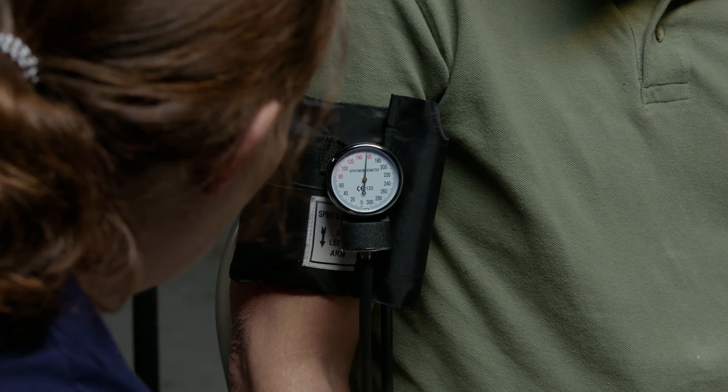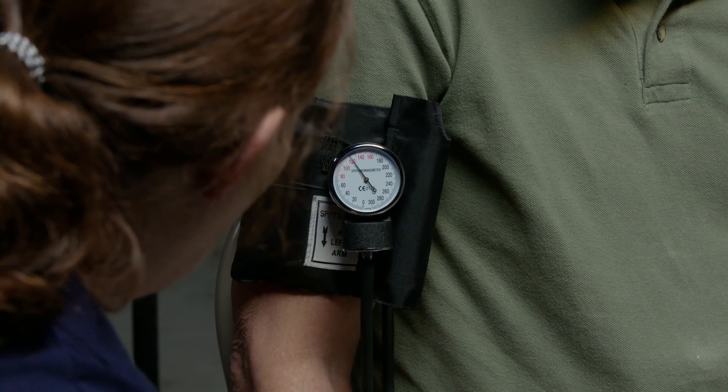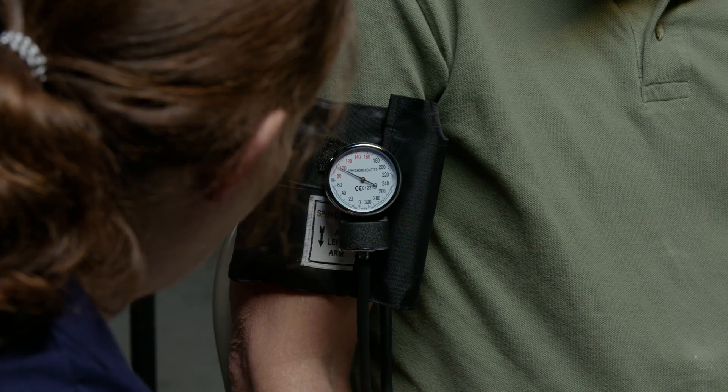You want to release the valve at about two to three marks per second.